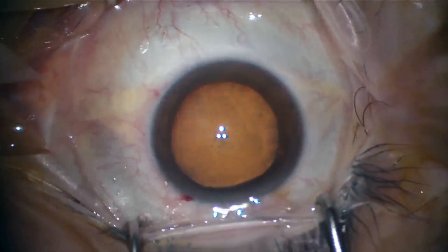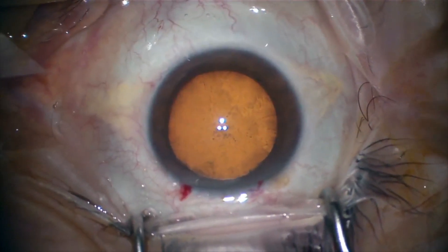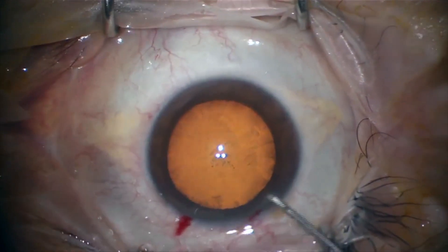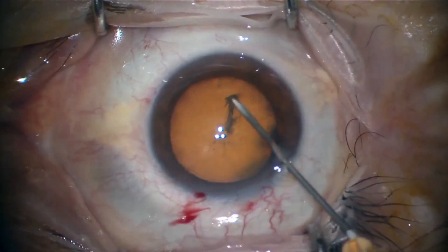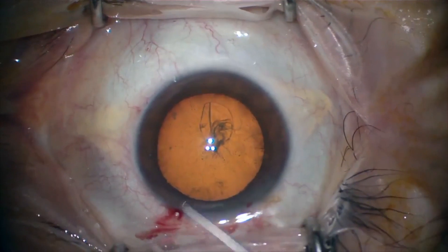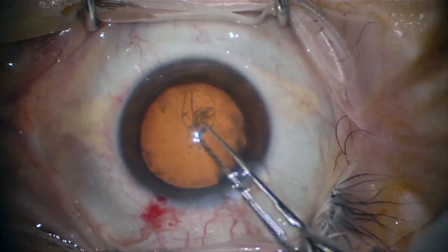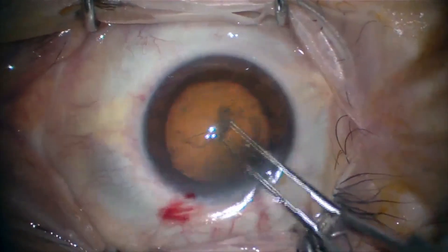We don't need to dye the anterior capsule with trypan blue at this moment. We just place viscoelastic, then use a 25 gauge needle — we do not use a cystotome at this time — and finally we use capsulorhexis forceps in order to make a 5.5 millimeter capsulorhexis.